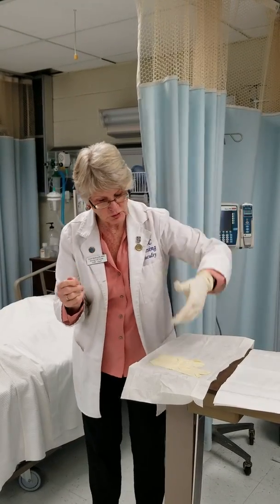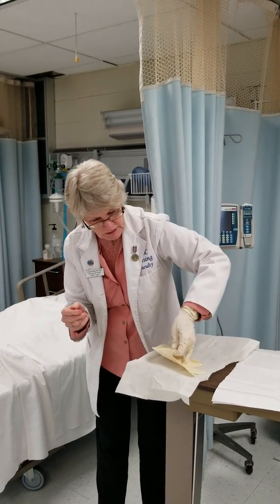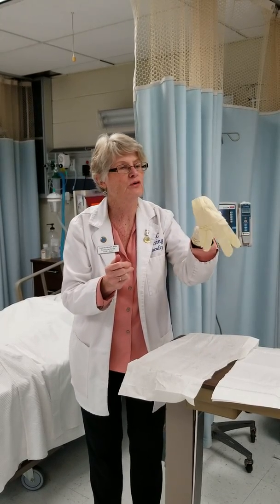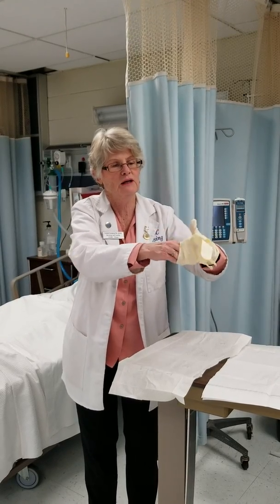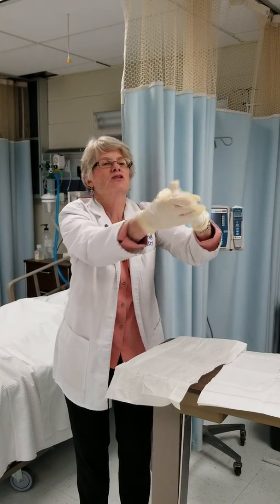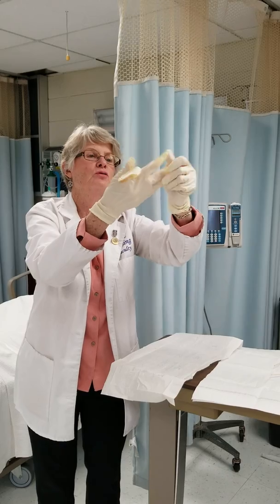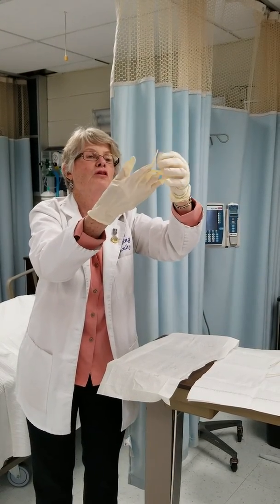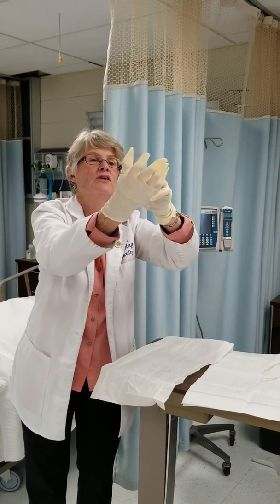Next, with my sterile hand, I'm going to grab this glove underneath the cuff, lifting it up. I have a thumb, we call that our hitchhiker thumb, that you keep out of the way while you now go ahead and put your other hand into the glove. At this time, I can fix the fingers to be the correct place because I am all sterile. So sterile to sterile works, and you can adjust your gloves as needed.